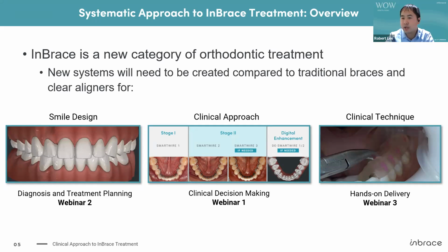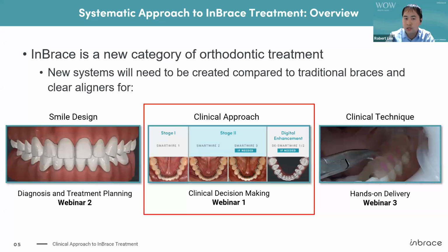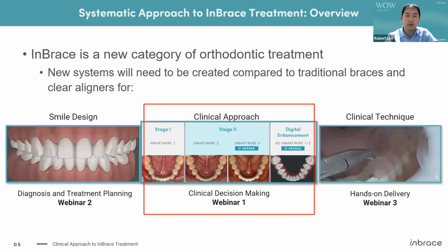And then the last part is your hands-on delivery. So, are you bonding things well so that you're not having a lot of bond failure? Are you able to put the wires in efficiently to have a good patient experience? So that's like your general clinical techniques. So today, what we'll be going over in this first webinar is the clinical approach. And then next week, I'll be going over smile design. And then in the following week, I'll be going through a lot of clinical cases, and in doing so, I'll be discussing the clinical technique in each of the appointments.